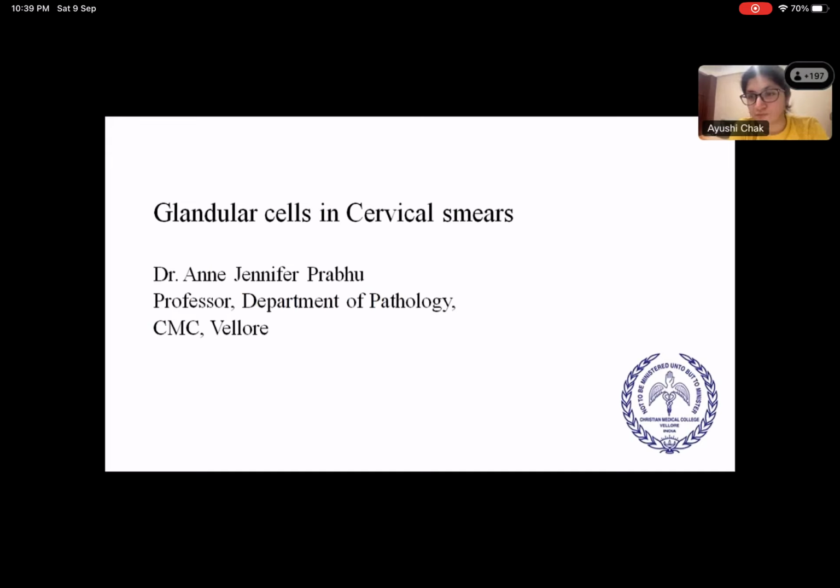So good evening, everyone. I hope all of you have had a good exposure now to the squamous part of the cervical cytology. Actually speaking, sir, the squamous part is much, much more important for you to understand and recognize, especially the normal morphology, and then to go on to see the abnormal morphology in squamous epithelial cells.